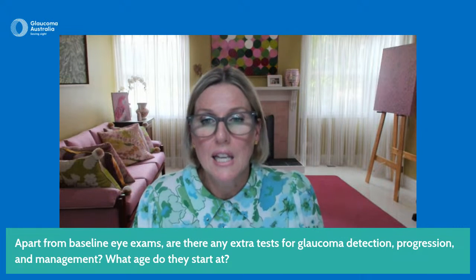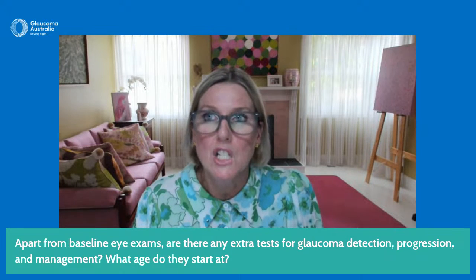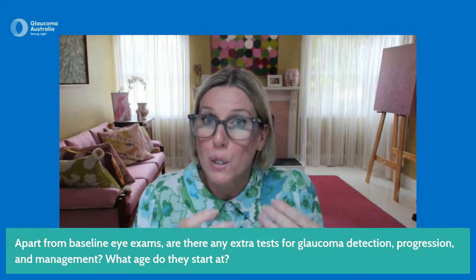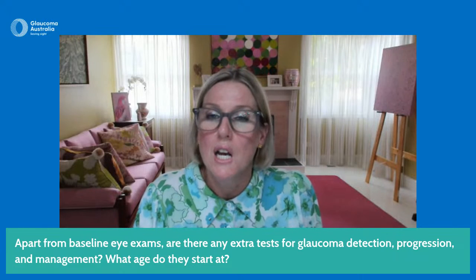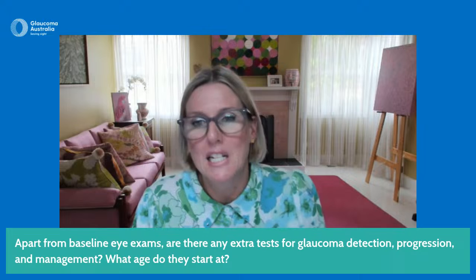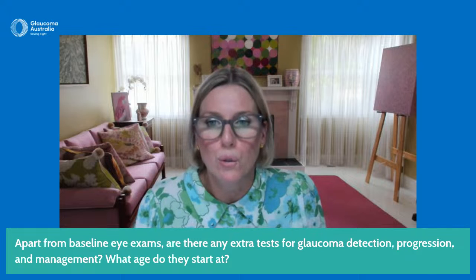That OCT scan of the hidden layers of the back of the eye is also one we like to get onto as soon as the child can cooperate, because it's showing perhaps some damage caused by the pressure that you actually can't see otherwise. So it's giving a really early indication of damage. And then we've also got the visual field testing, but that does come later. We haven't had a test designed yet that's accurate enough to be performed on the very young children. So they would be the main tests.